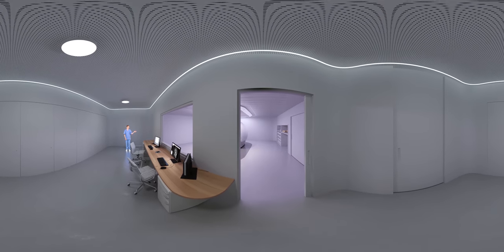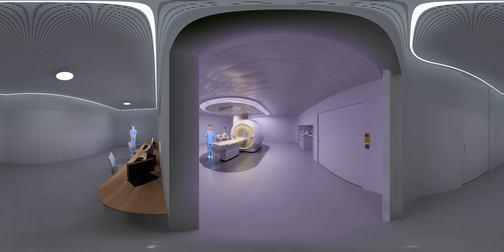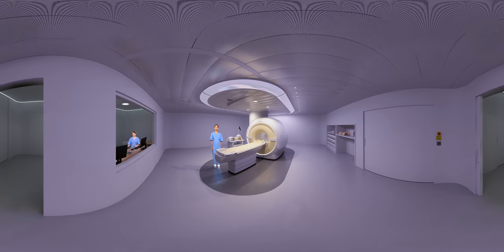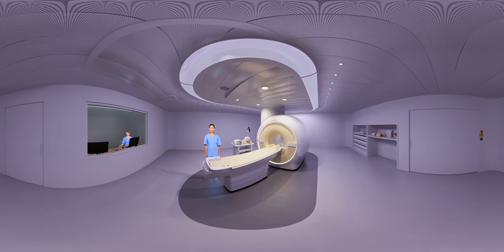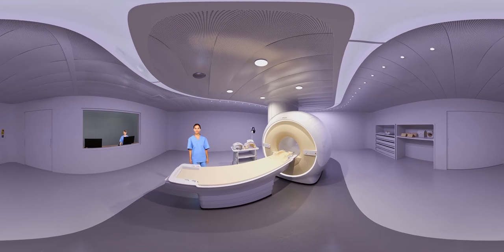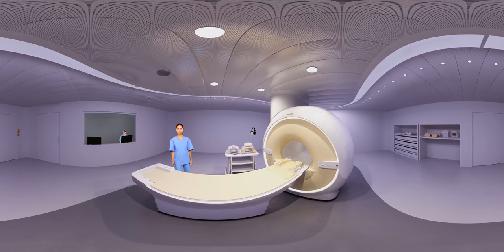It's time for your exam. This is the MRI room. Can you hear the rhythmic noise? This is the sound the scanner makes and is perfectly normal. This is the MRI scanner and its table. Several scans will be made, each one lasting a few minutes. The MRI machine will make loud rhythmic noises — this is perfectly okay, it means the machine is scanning.